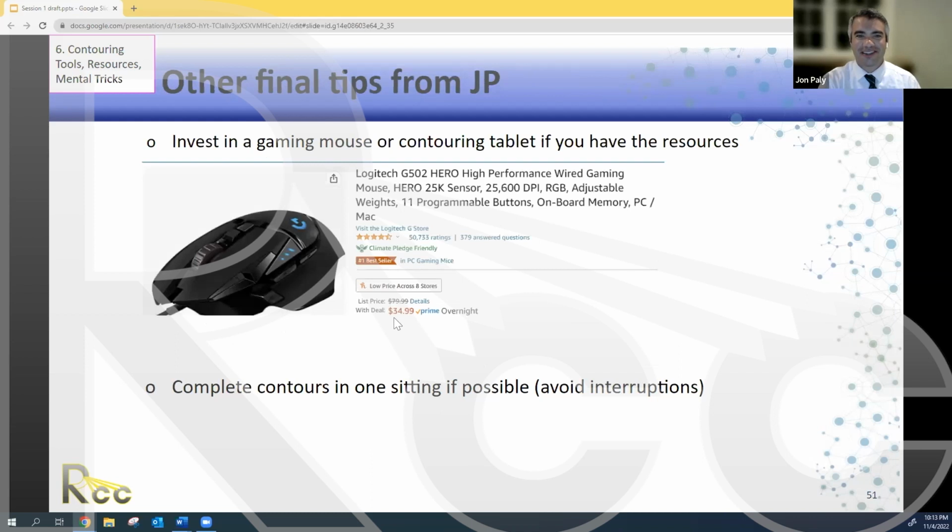And these are two very miscellaneous final tips from me that I've found helpful. So I think it is worthwhile to invest in a proper mouse for your contouring. I use a gaming mouse here that I purchased on my own. It has a lot of extra buttons, which I'm not using for any online gaming, but is really helpful in the treatment planning software to have hot links to different tools right at your fingertips. You can also unlock the mouse button or the scroll button and in 2 seconds scroll from the top to the bottom of a CAT scan, which is really helpful for me.